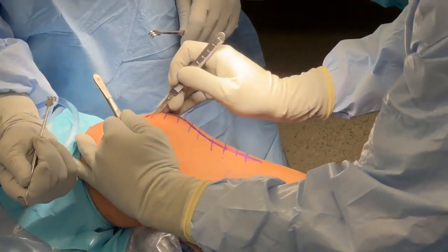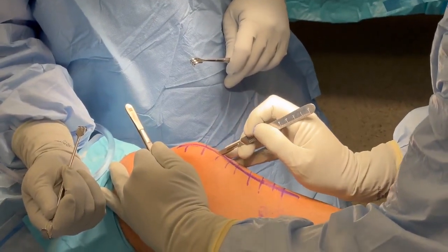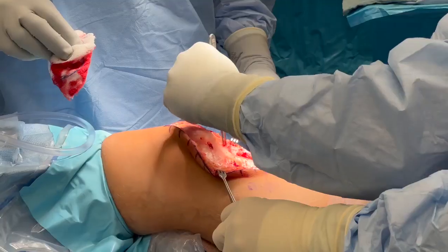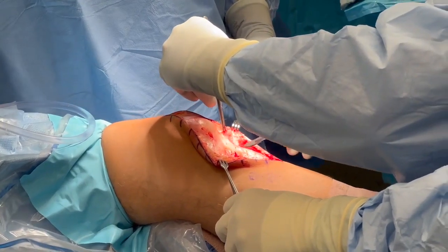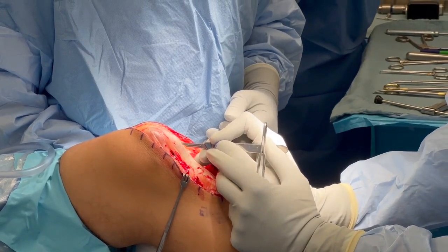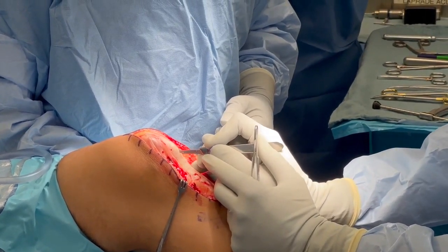The surgical approach was performed first with an anterior knee incision that extended from superior to the patella to distal to the tibial tuberosity. A fine dissection was carried out down to the extensor mechanism. After exposing the extensor mechanism, the sharp debridement of the patellar tendon can be performed.